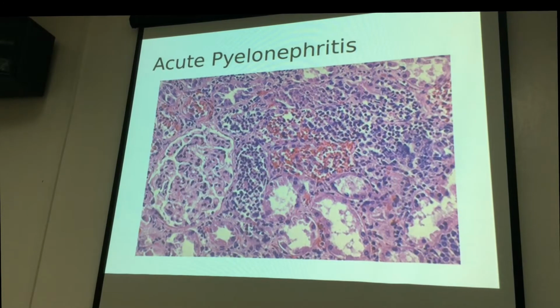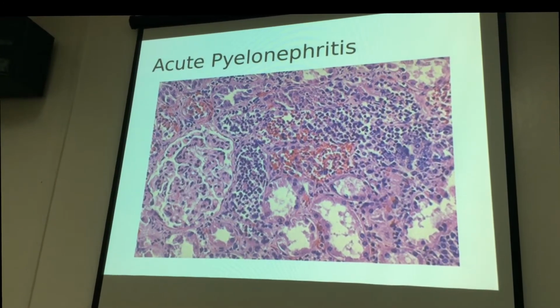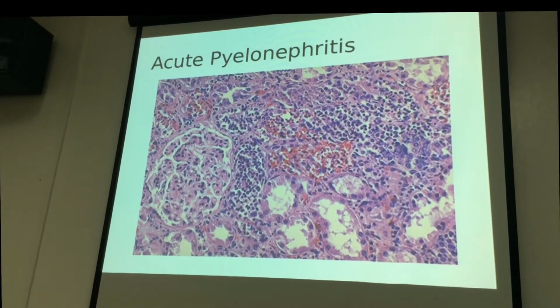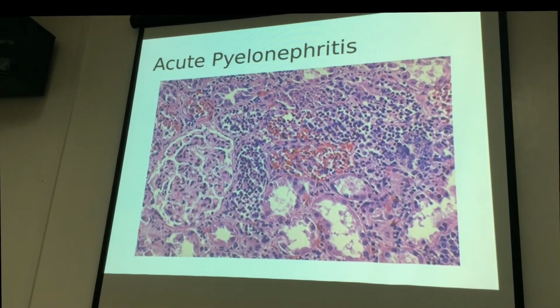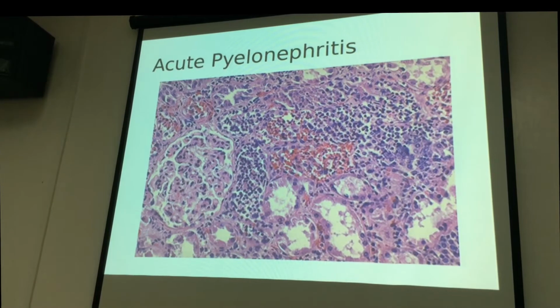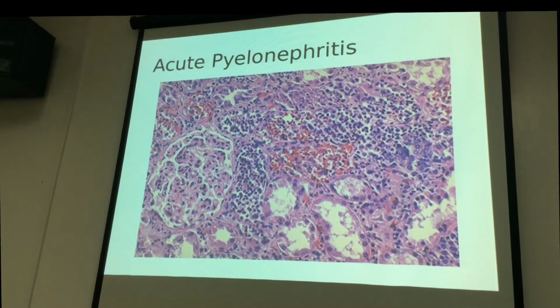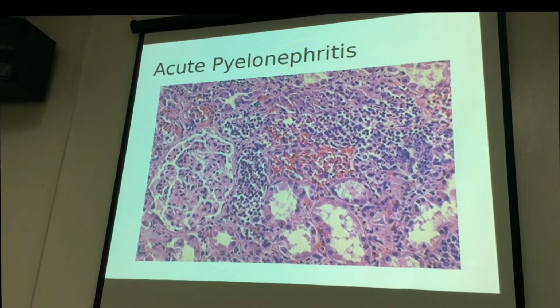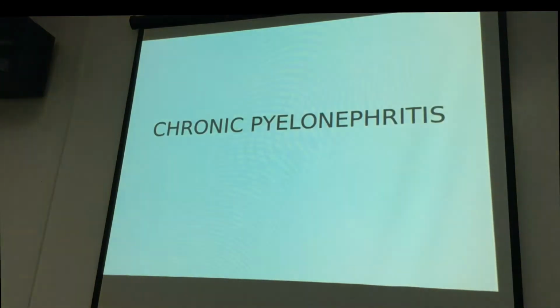So urinalysis findings, as I've said, you will have pyuria or WBC in the urine as well as WBC casts. In some instances, the necrotic renal tubular cells will also be passed into the urine and you will observe them as granular casts. The degenerated WBCs will also become granular casts. So there are two forms of granular casts in the urine. You have your coarse granular and you have your fine granular casts.